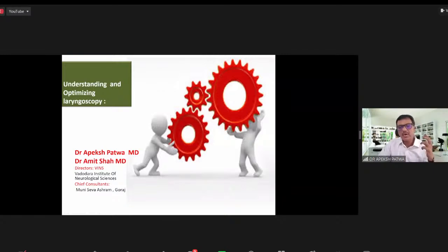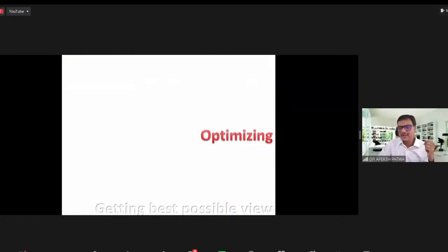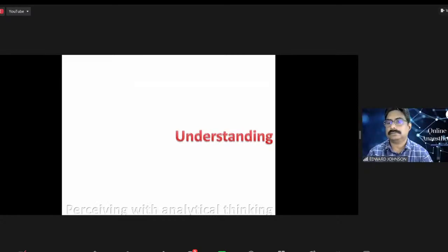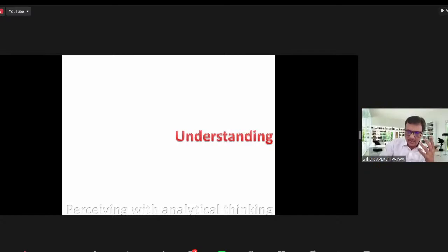So my talk is on understanding and optimizing. What do you mean by optimizing? Optimizing laryngoscopy means getting the best possible view. And understanding laryngoscopy means perceiving the anatomy and performance of laryngoscopy with analytical thinking.